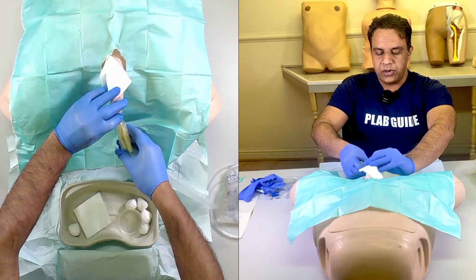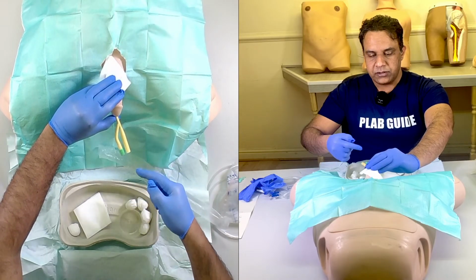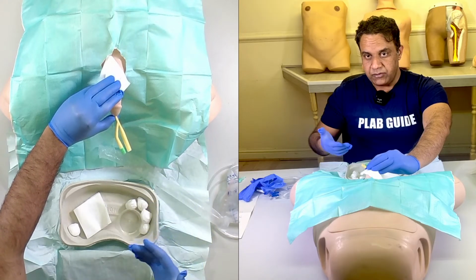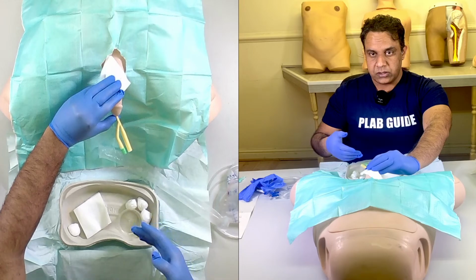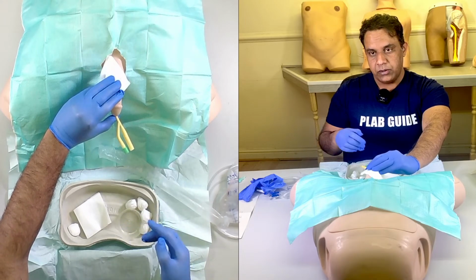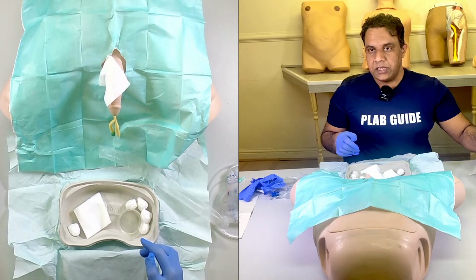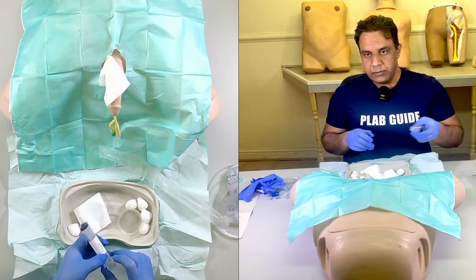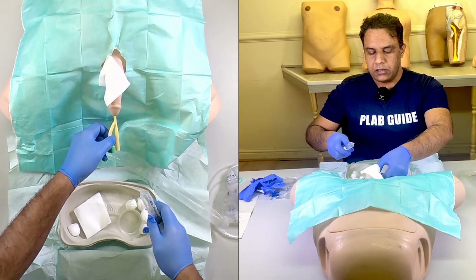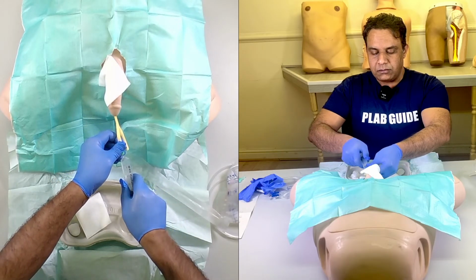At this point, normally in a patient, we should expect the urine to come out. For the sake of your examination, it may not be connected to the water tank and you may not get the urine. You can ask the examiner. Then the next thing that usually comes in the packet is a saline flush.